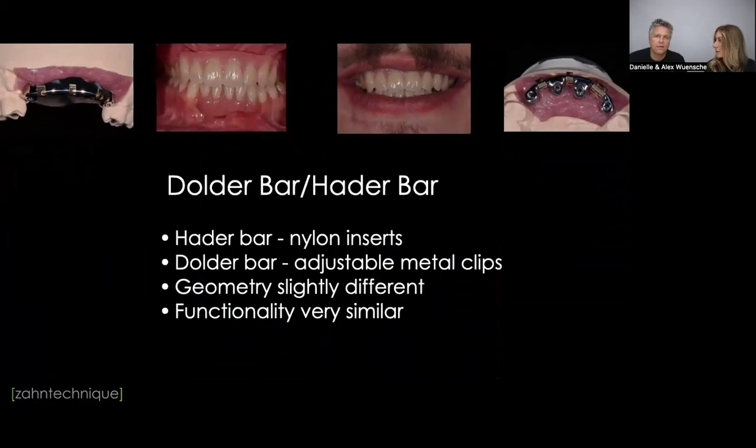What I like about that metal is that you can activate them, right? You can actually bend them slightly to make it tighter. What you can bend can be de-bended, right? So over time, it'll open up a little bit. But I think the longevity of a case like this is a little bit better than with the nylon clips, because you definitely can activate these clips nicer and for a longer time, basically.